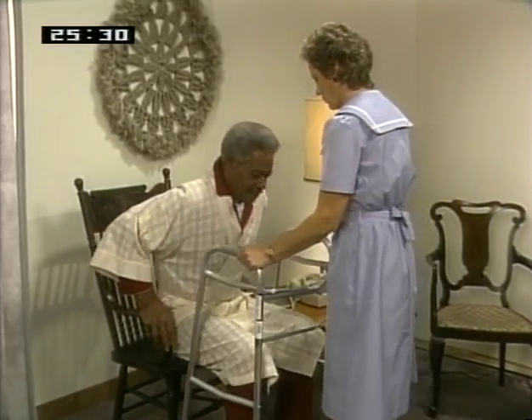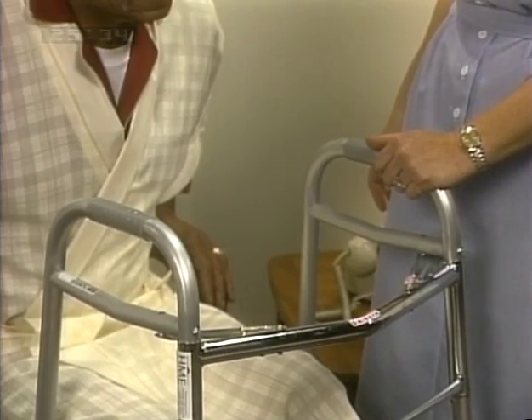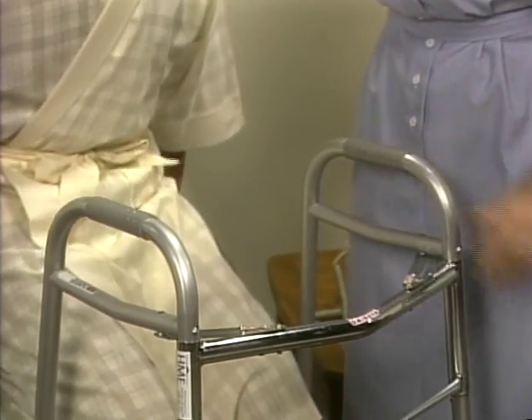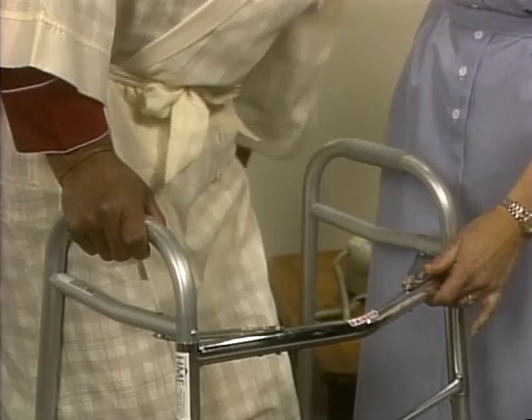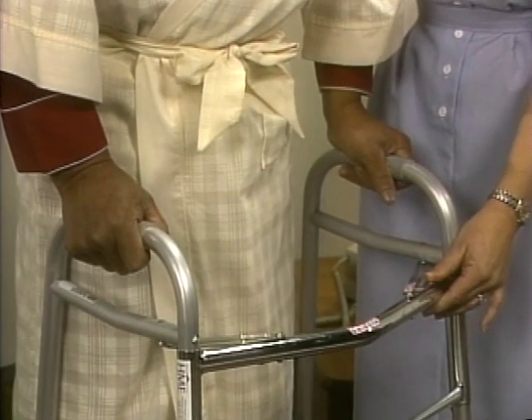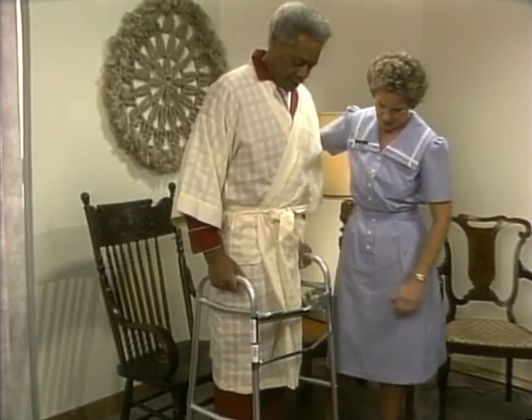It's time for Tom's rest period, so Judy will assist Tom to walk to bed using the walker. To do this, place the walker directly in front of the patient so the patient can comfortably reach the hand grips without overextending. Have the patient push on the arms of the chair to move himself to a standing position. Continue to support the patient until he has a firm hold on the hand grips of the walker with his feet firmly planted. Give him a minute to gain his balance.